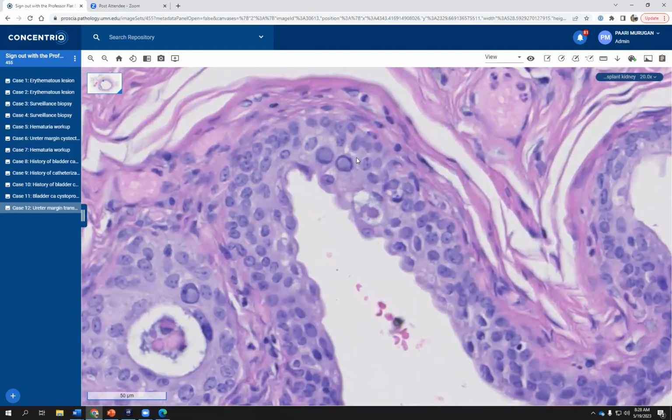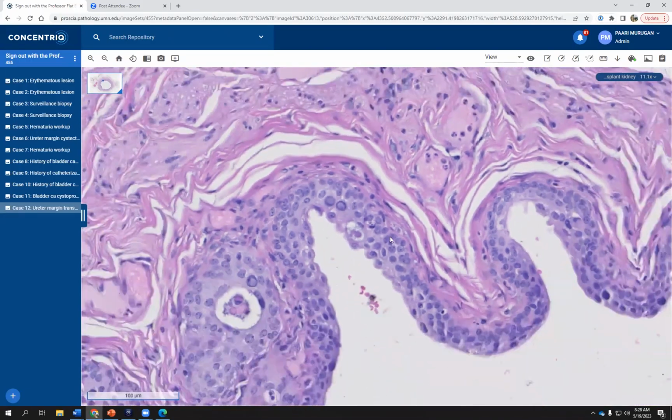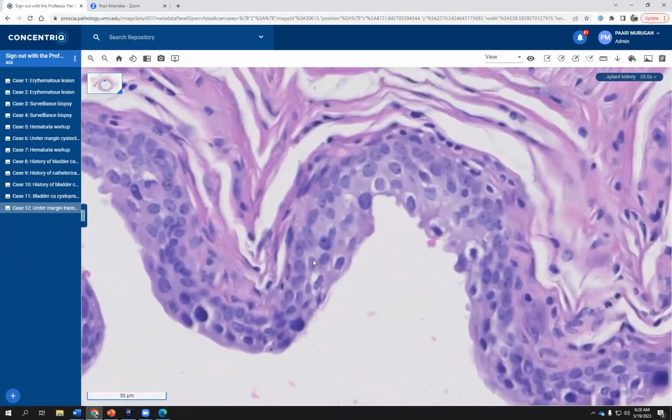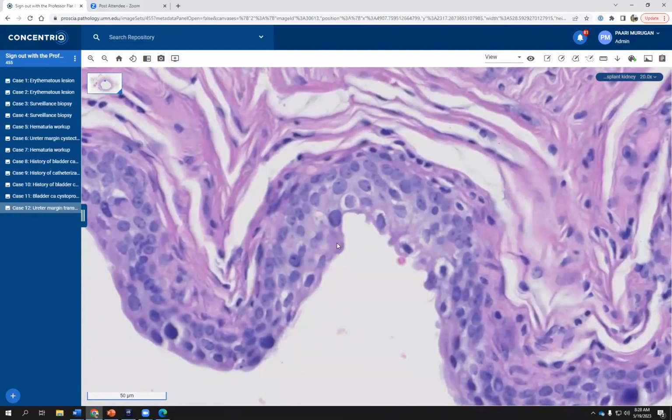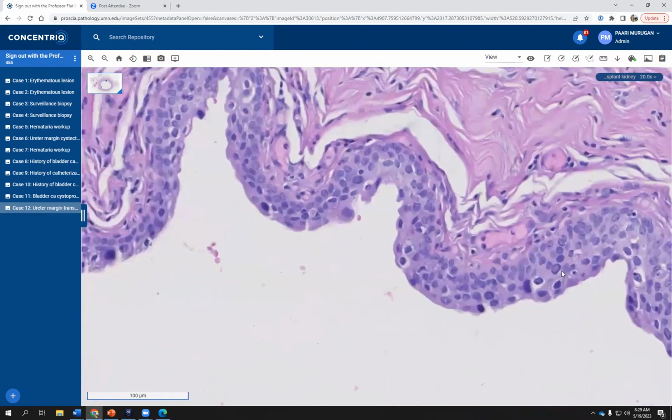And of course, this is a transplant patient, so they are immunocompromised, so they have a higher incidence of BK virus infection. This is a classic cytopathic feature of viral infection where you see central nuclear homogenization with peripheral displacement of chromatin, which might sometimes mimic carcinoma in situ or atypia for the unwary, especially when you see such a hyperchromatic nucleus. You have to keep looking around till you come across some cells that show a more clear example of cytopathic viral change, the central clearing and the peripheral margination of chromatin. So this is a BK virus or polyoma infection.